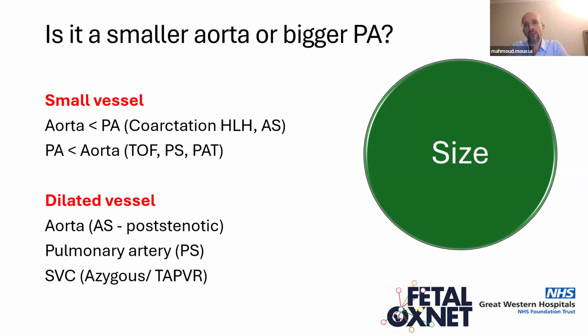How would you know if the vessel is big or the other vessel is small? This is a bit of a dilemma, and sometimes it makes it a bit difficult for the diagnosis, but always remember, we do not examine the planes, we examine the heart, and always use this as a way of thinking when you're doing heart assessment for the baby.